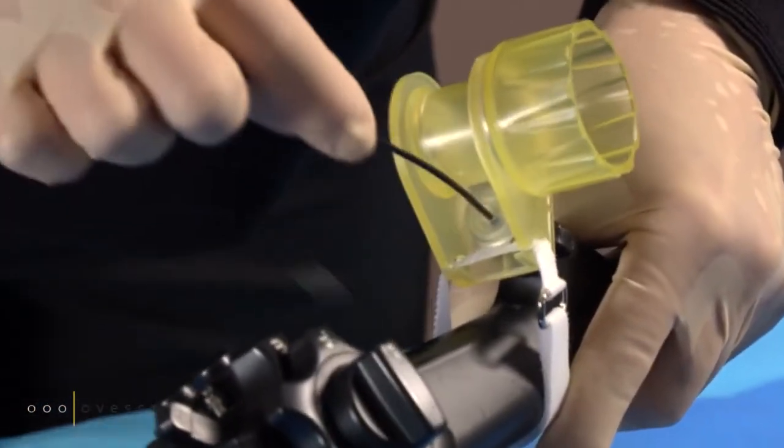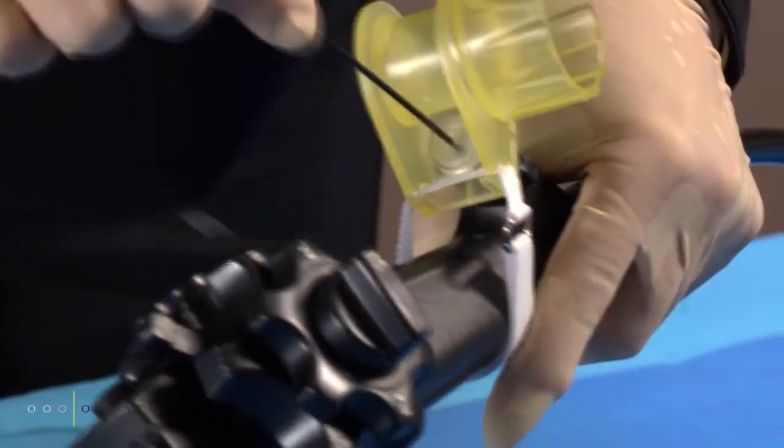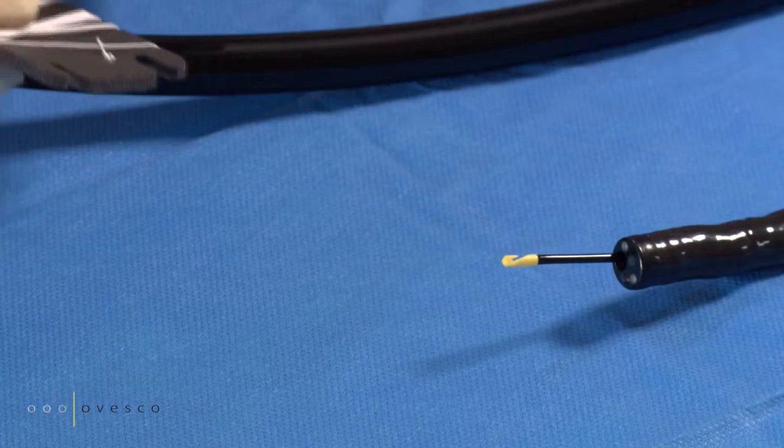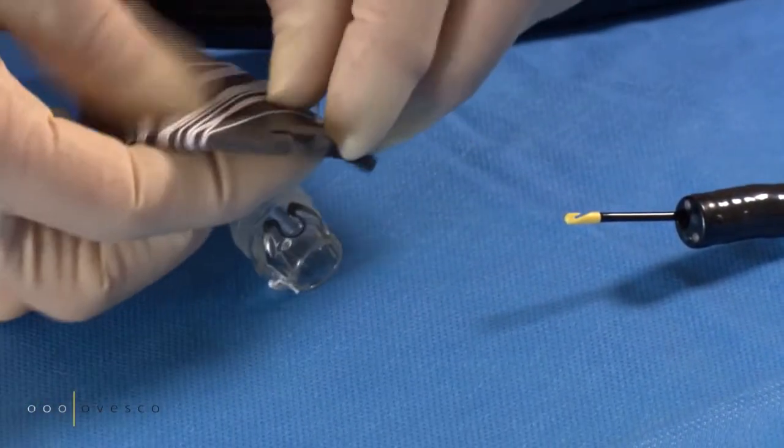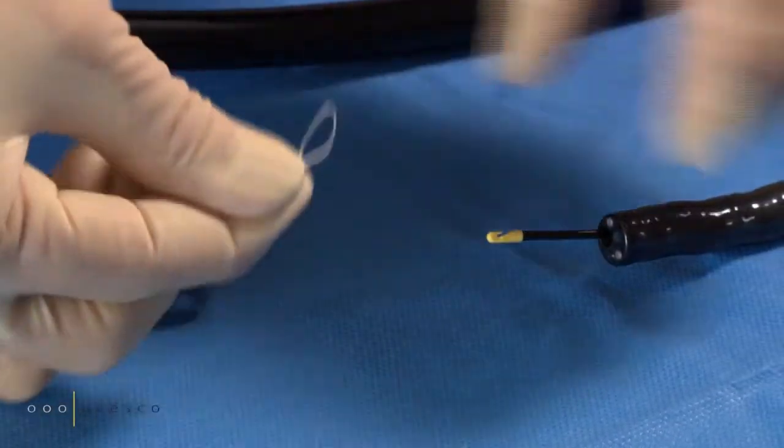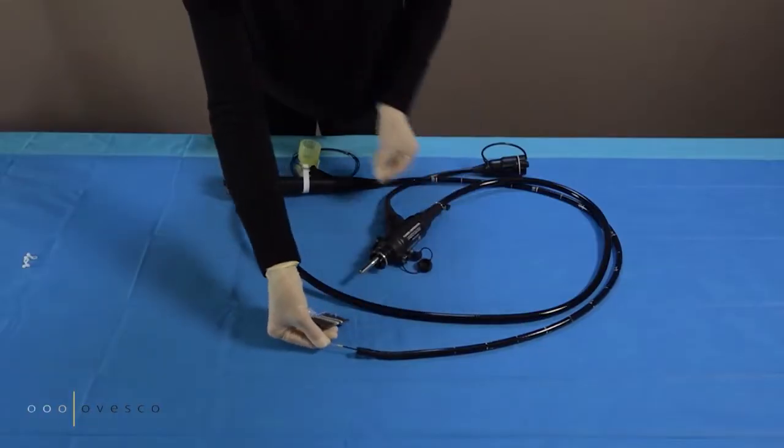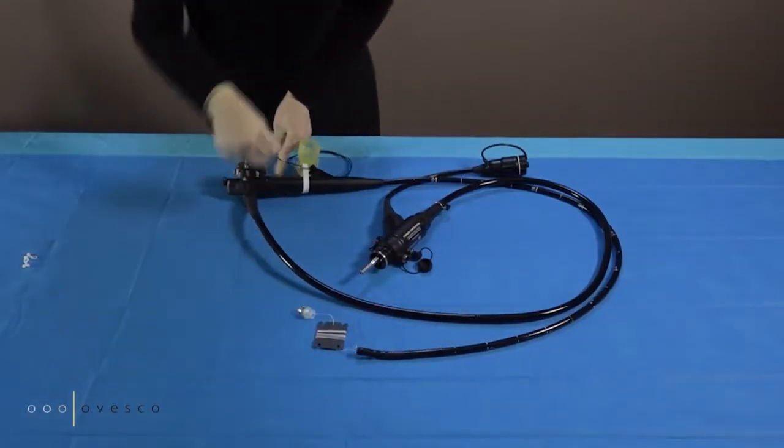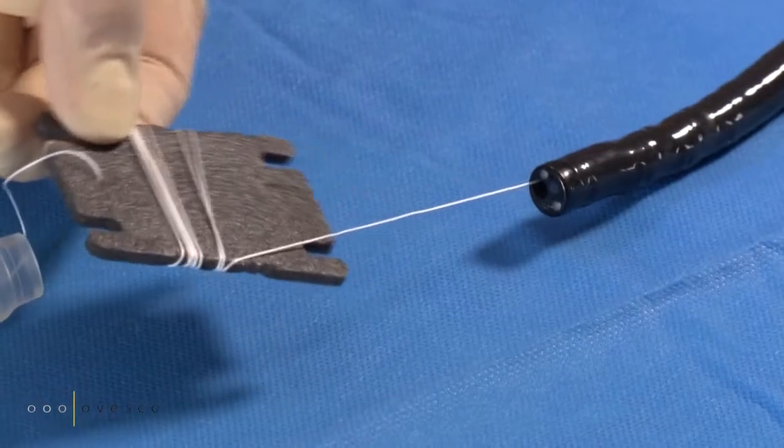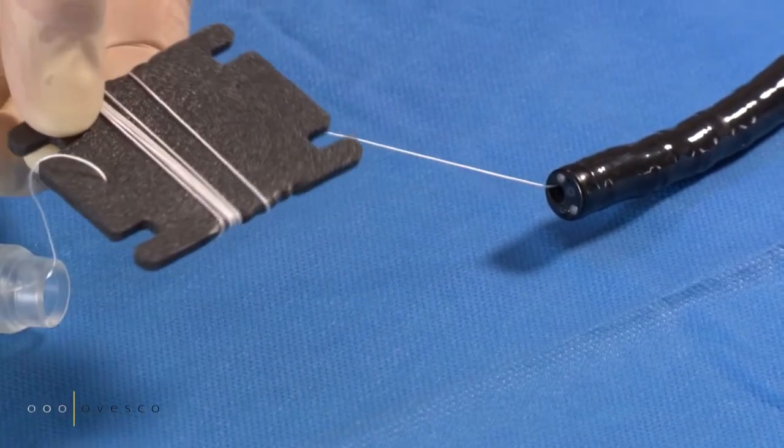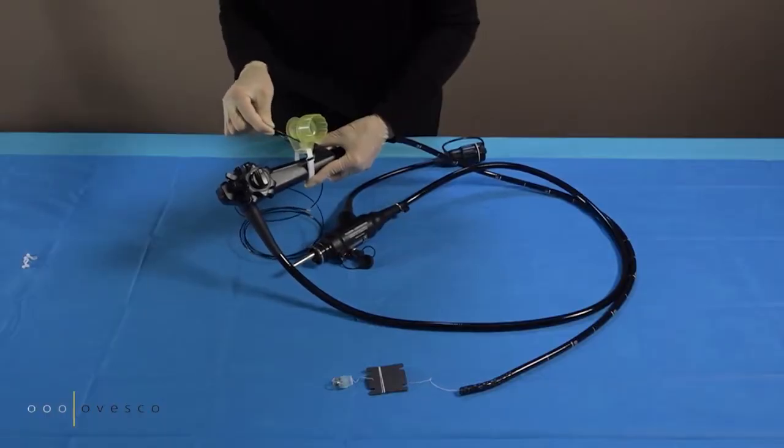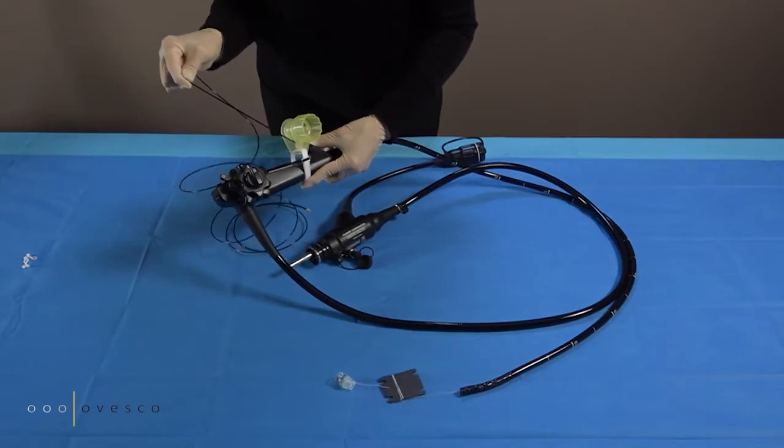Insert the thread retriever into the working channel. Grasp the end of the thread and pull it through. Click the endoscope through the channel.